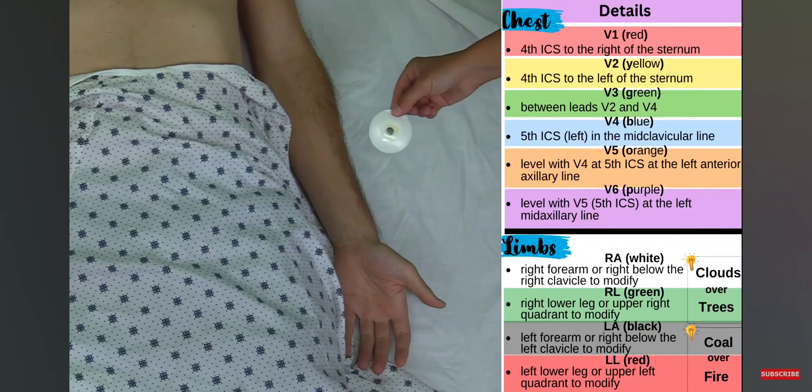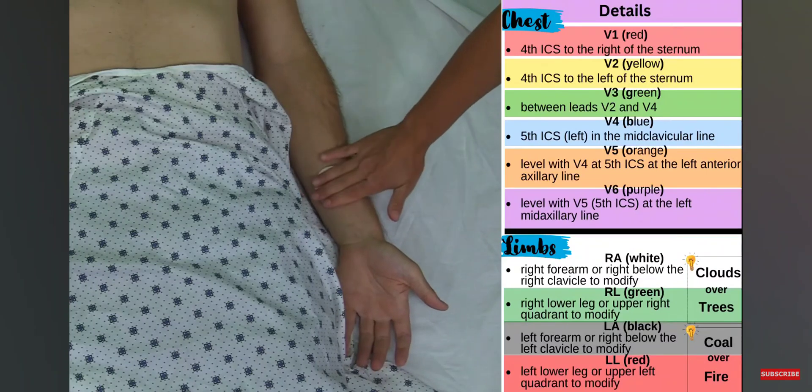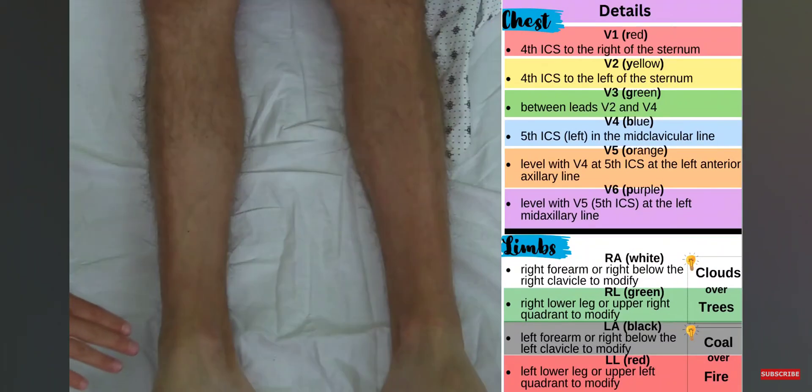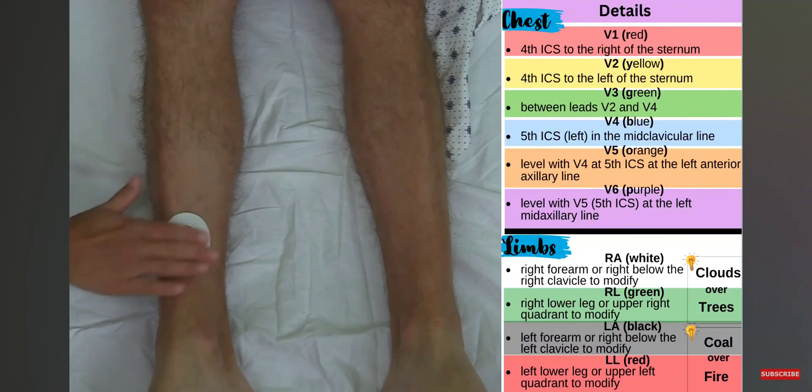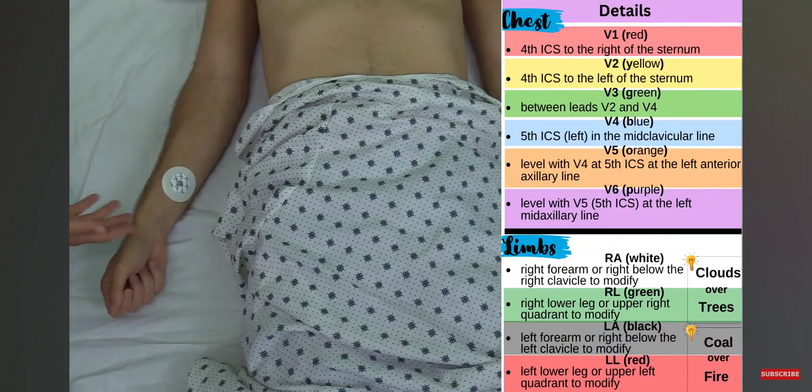Now I'm going to the left arm and place the electrode at about the same place I did on the right side — I want them to be equal — pressing firmly. Then I come to the right leg, going above the ankle and placing the electrode here, pressing firmly. Lastly, I come to the left leg and place the electrode equal to the right leg.